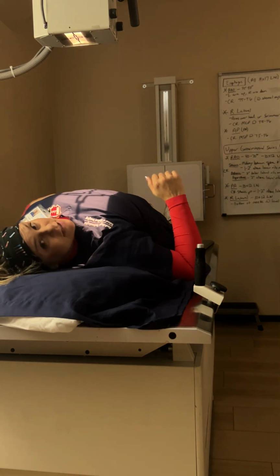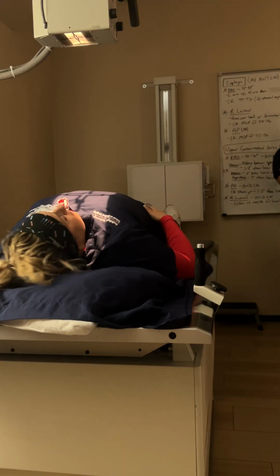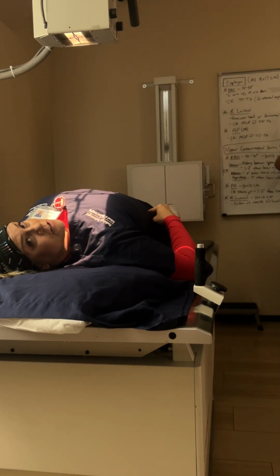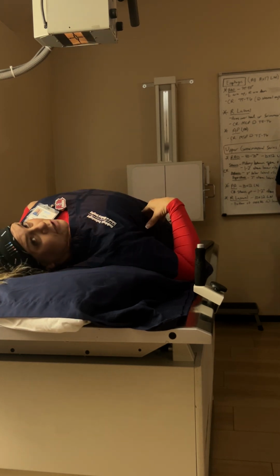I would say we don't start with the RAO. Honestly, it's kind of like when the doctor tells you to take overheads, he tells you exactly what overheads you want. So he'll tell you, "Oh, just get a lateral," or "I want RAO and lateral." So it doesn't really matter. Okay, just do it this way.